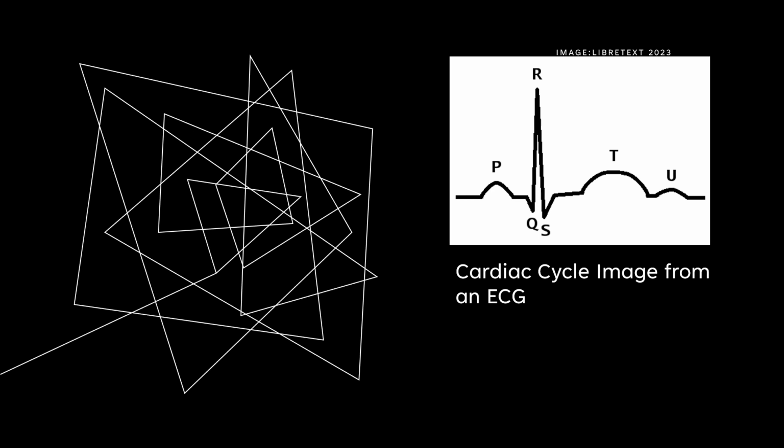During a myocardial infarction, the ST complex, this right here, represents the time when the ventricles are depolarized before repolarization begins. This is usually elevated. Atrial fibrillation is presented by a missing P wave with rapid, irregular, and not very efficient atrial contractions.